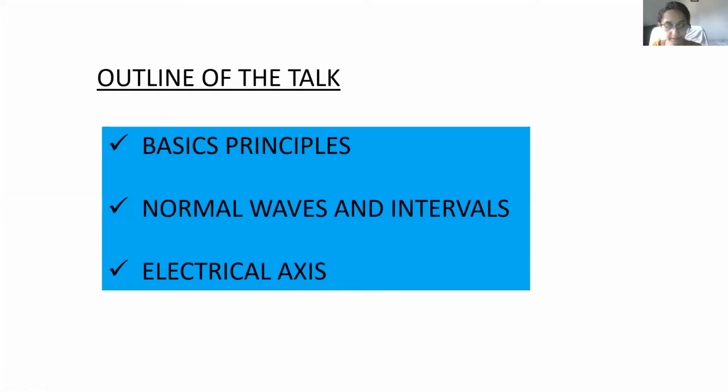Friends, today's session is going to be a continuation of last week's session related to basics of ECG. The first 5 minutes, I'm just going to run through what we learned last week. So it'll be like a recap, and then we will move forward. Last week, we had gone through the basic principles and the normal waves. So today we will see the intervals and the segments and about electrical axis.